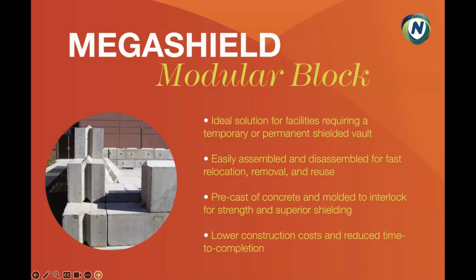The third would be accuracy and testing. Each block can be tested for any leaks, any damage to the block that was made during the curing process prior to it being installed. So each block is serialized, and it's proof of concept before it arrives on site.